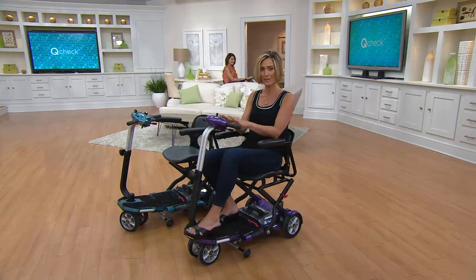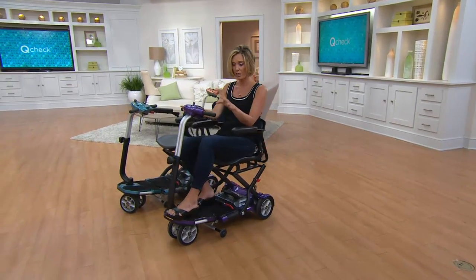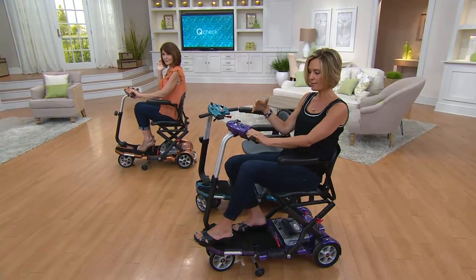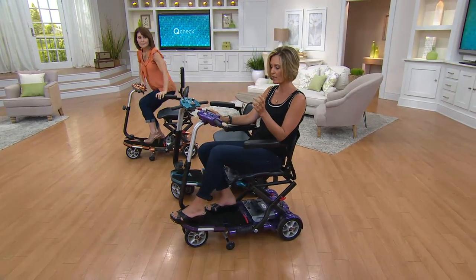We're going to take you through all the controls — it could not be simpler. You can go forward and you can also go in reverse. It's an electromagnetic brake system, so you just let go and it stops. It's not some weird jolting thing — it's just super, super easy.